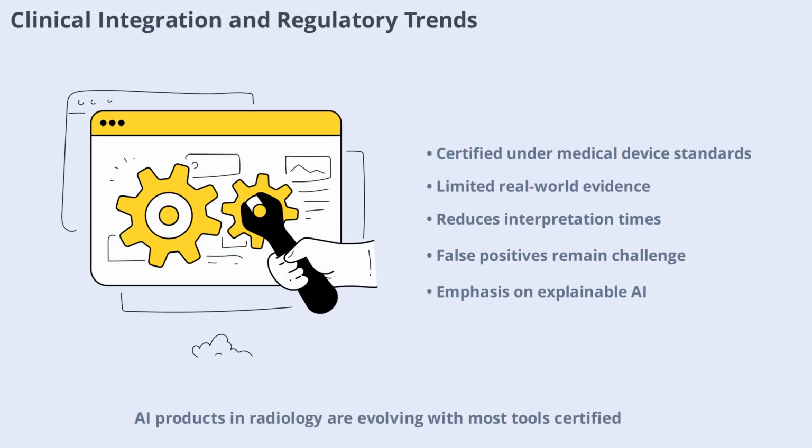AI products in radiology are evolving, with most tools certified under moderate-risk medical device standards. Despite rapid research advancements, evidence for effectiveness in real-world settings is limited. AI reduces interpretation times and improves workflow efficiency, but challenges like false positives and black box decision-making persist. Trends for 2024-2025 emphasize multimodal and explainable AI to enhance clinical insight and trust.